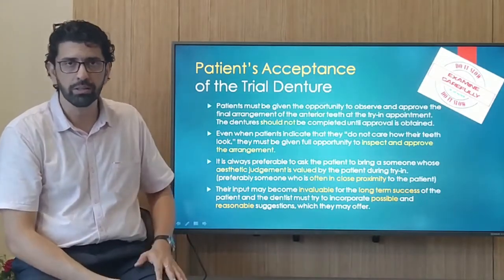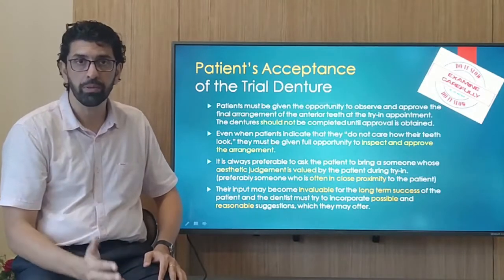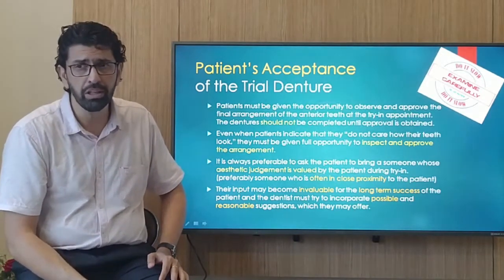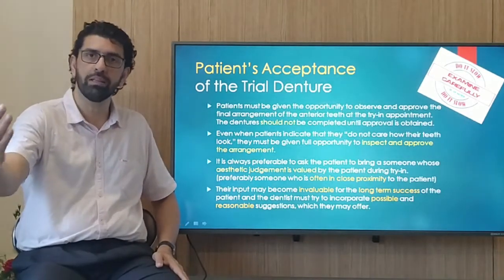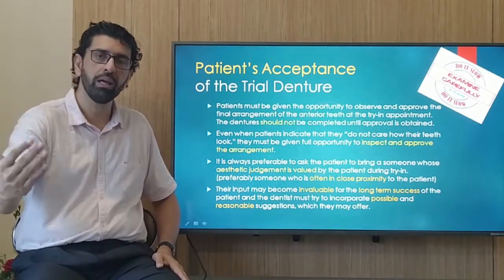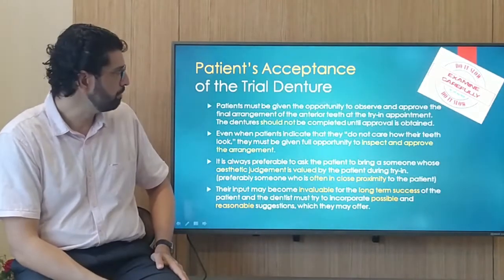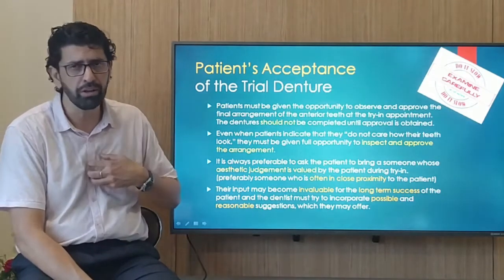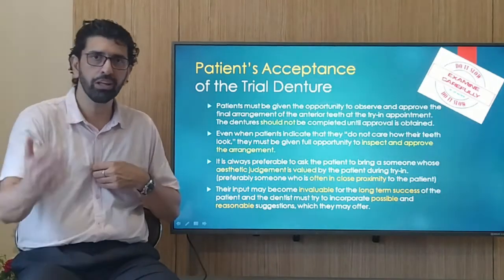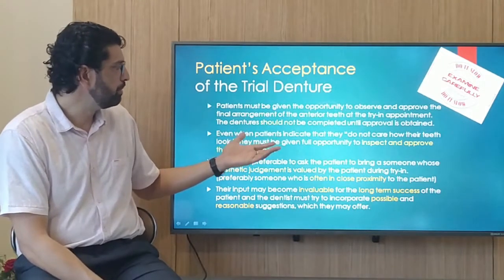So you can tell the patient that, but patients oftentimes like to take the mirror and look at it very closely. So I don't think we need to completely restrict them from doing that. Make them aware that this is how people see it, from the distance from which people see it, and let them have their freedom at looking at the teeth a little bit more closely. Because they will enjoy that freedom that you give. Otherwise they feel that you are trying to hide something, so you're not letting them have a closer look at what they're getting. So let them have a look.